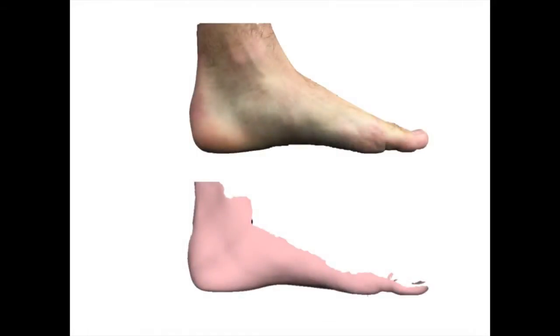You then need to see if peak arch height and the shape of the arch in the captured image is comparable to the patient's foot.